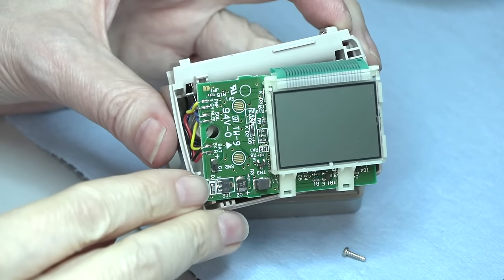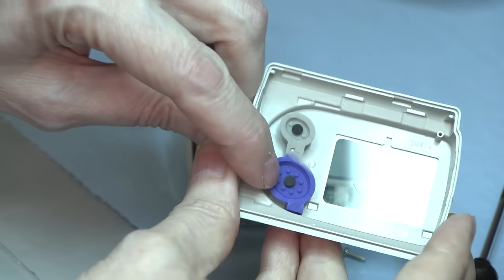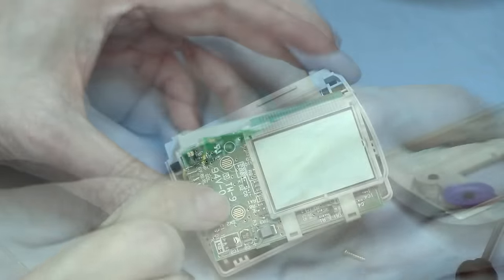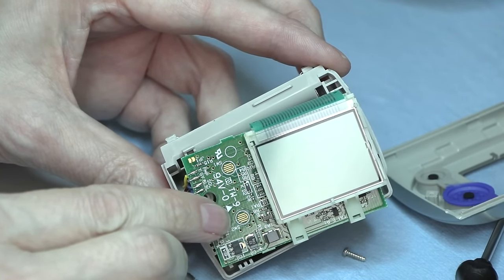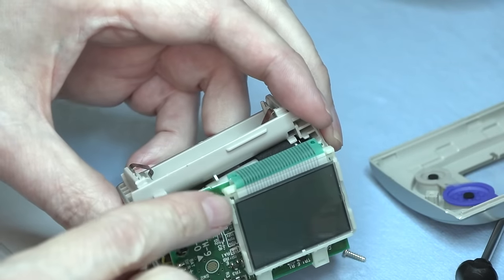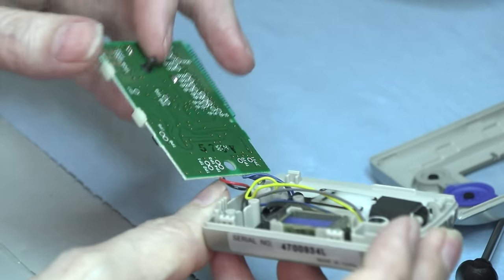There's the screen. Some switches there. Carbon two-shot switches there. Just little rubbery switches with a little carbon dot interface with those little switch traces on the board. Got a zebra strip. The old zebra strip.